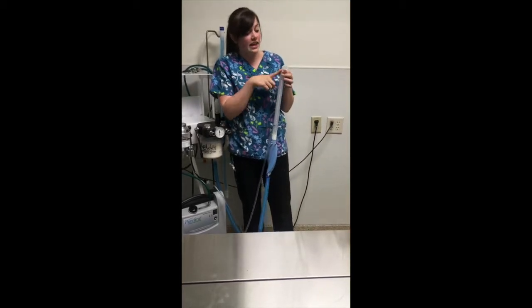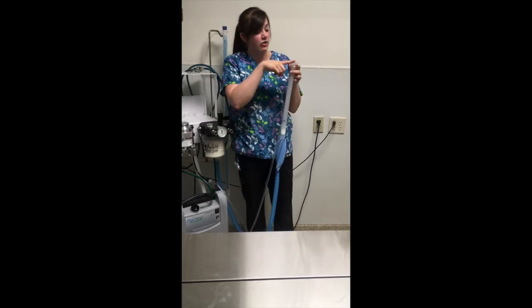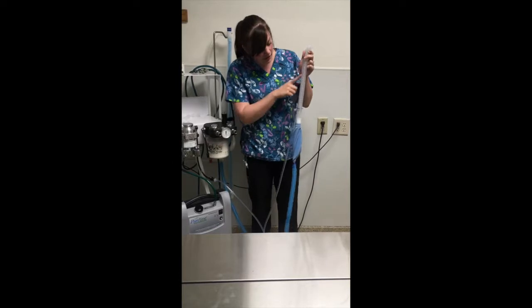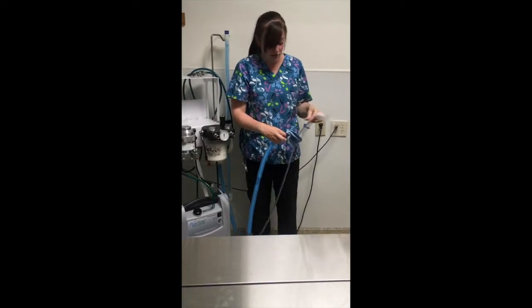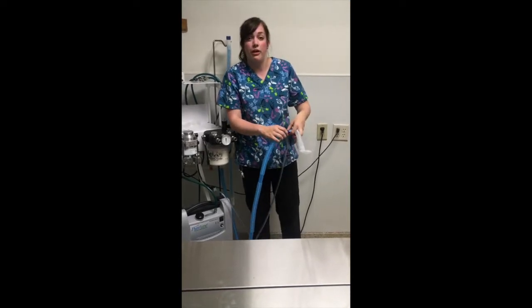When the patient exhales, all the exhaled gases, because this is a high flow rate, are going to get pushed down this corrugated tubing instead of back through here. It's going to come down the corrugated tubing into our reservoir bag. So the reservoir bag can actually be turned shut off or open, depending on if we need to give the patient a breath or not.